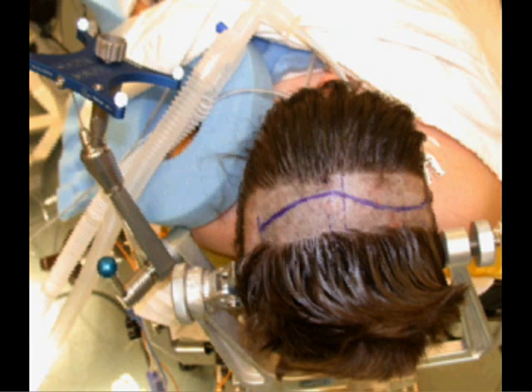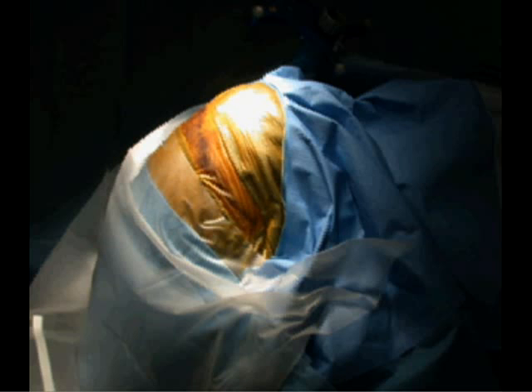The patient is positioned supine, head flexed, in a Mayfield head holder with the torso elevated at approximately 20 degrees.